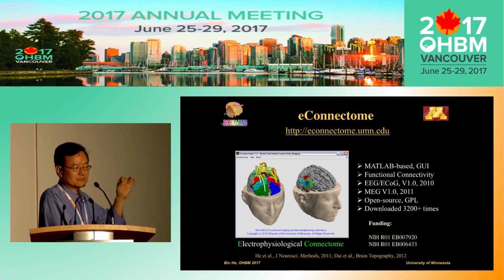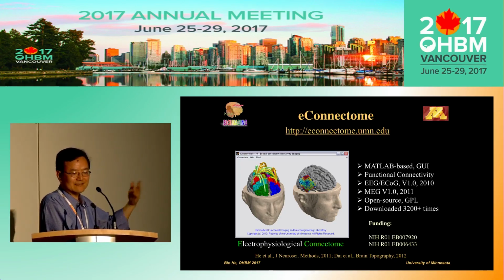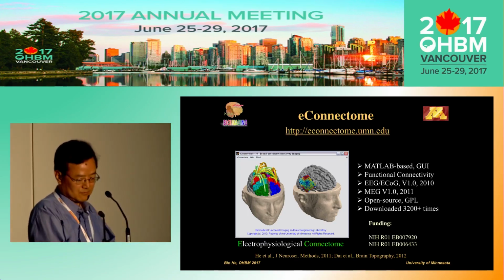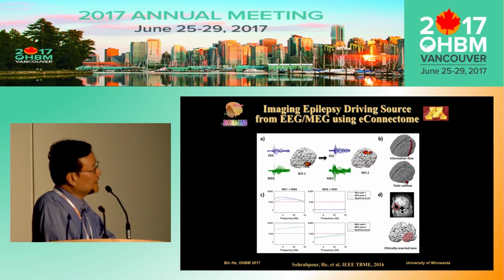You could do minimum norm and cortical current density imaging, and you could illustrate the Granger causality based information flow. Everyone is welcome to download and use this if you're interested, and we apply this to MEG as well. I will skip here.